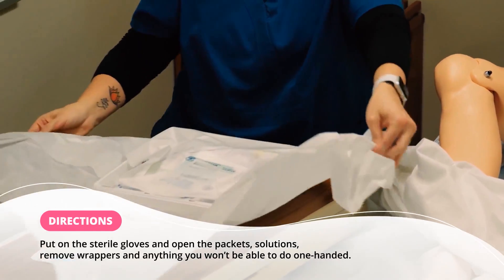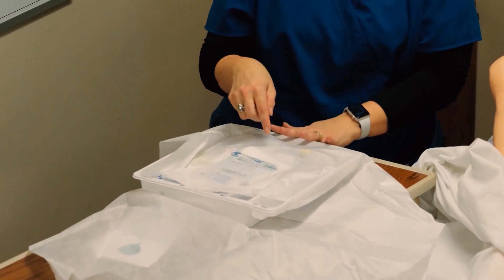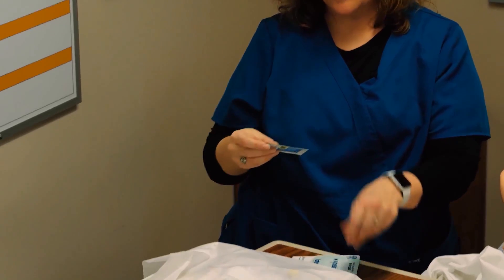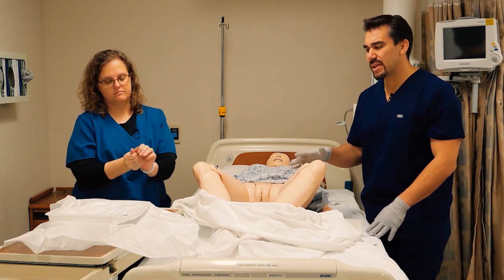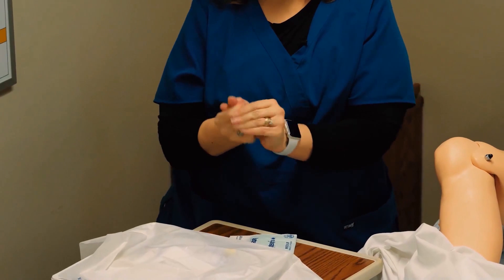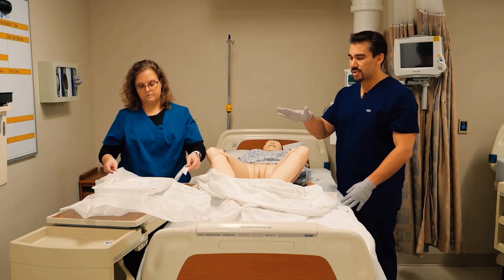I'm going to open this kit — the outside edges are things you can touch, but the inside edges aren't. Every kit could be packaged a little differently. You'll see that the gloves are on this side, and there's that hand sanitizer I mentioned with the gloves. Always — especially in nursing school — have an extra pair of sterile gloves, because you never know when you're going to break sterile field. If you've got somebody helping you, they should have sterile gloves too. You can always put them back if you don't use them. Never walk away from your sterile kit open — always keep eyes on it.